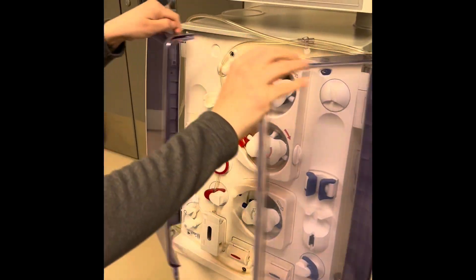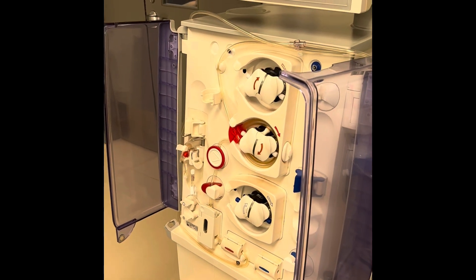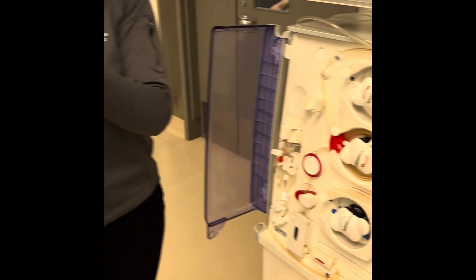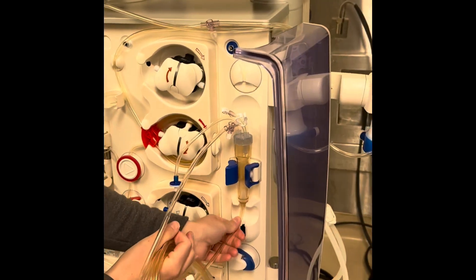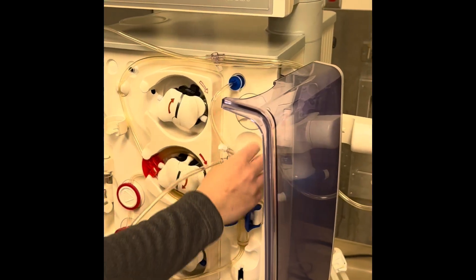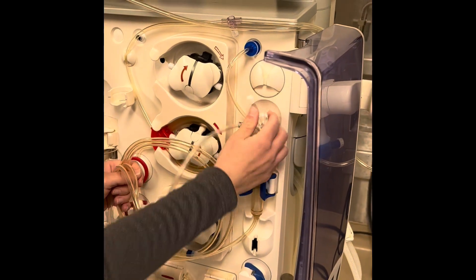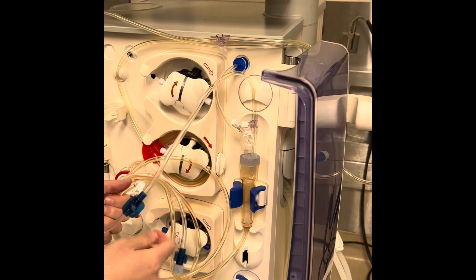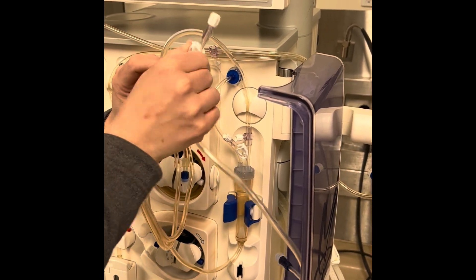Now I'm going to move on to my venous segment. I'm going to take my venous chamber and put it in the holder. I'm going to take my transducer and attach it. I'm going to clamp my medication port right here — you need to clamp it.